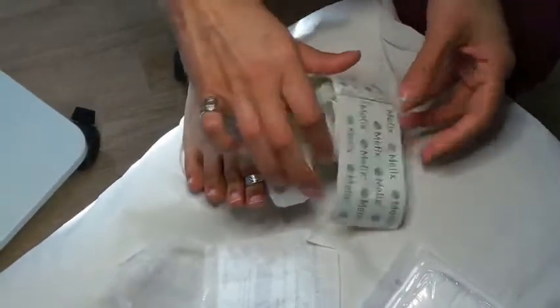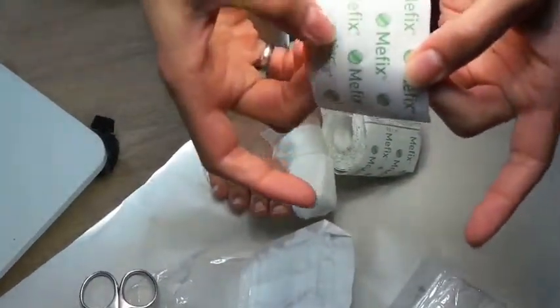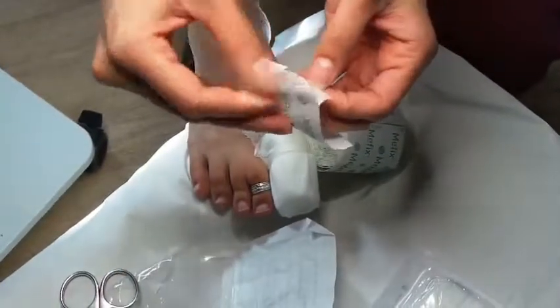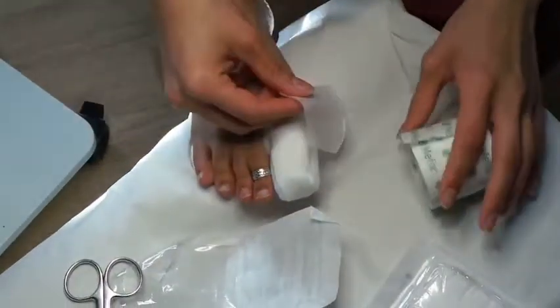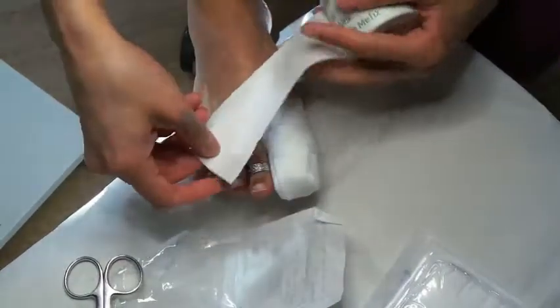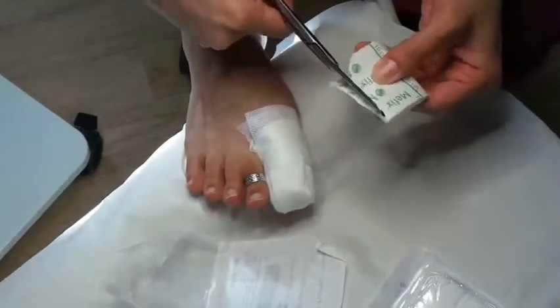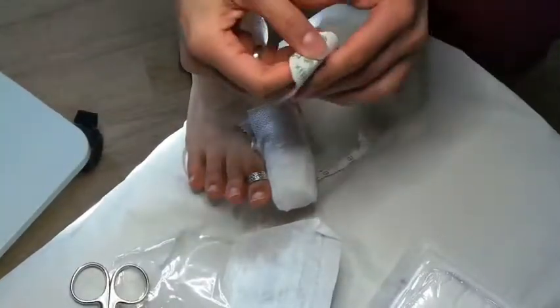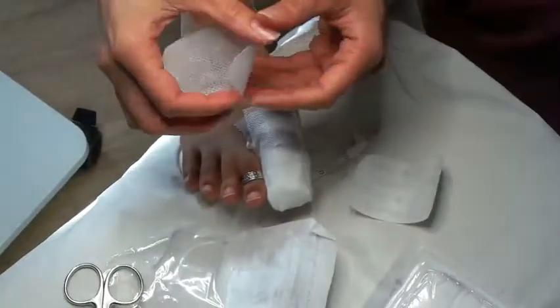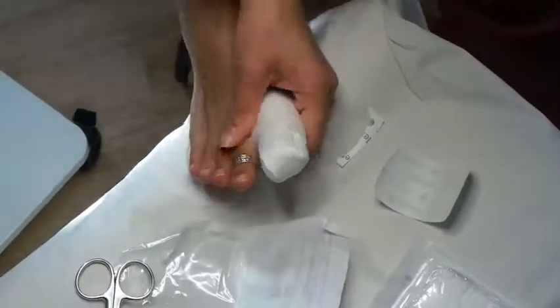You'll also have in your bag some mefix, which is notoriously difficult to open. There's a little line down the back — hold either side and pull, and you can see it separates the paper from the tape. What I'd recommend is to take your big piece of mefix, cut a little bit off, fold it in half, and round the edges so it's less likely to come loose. Hold it like this, draw your finger down and it usually comes off — but if not, just split it as described.